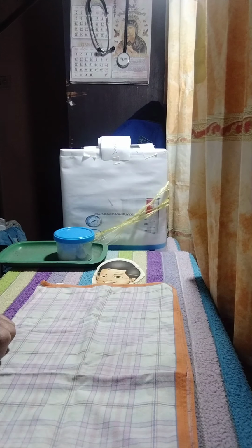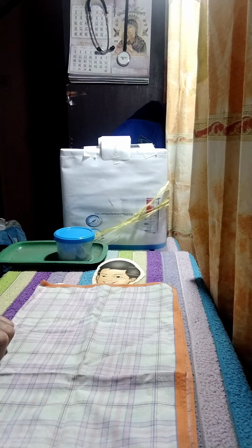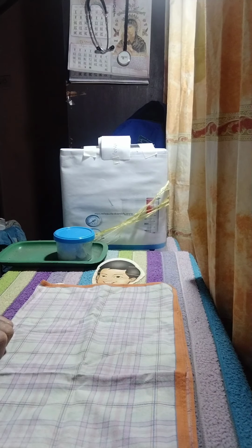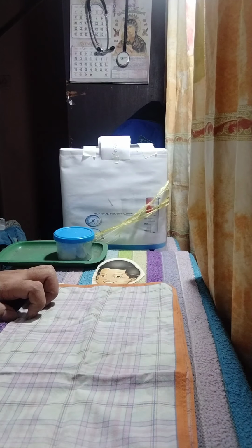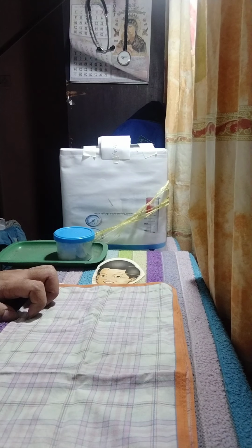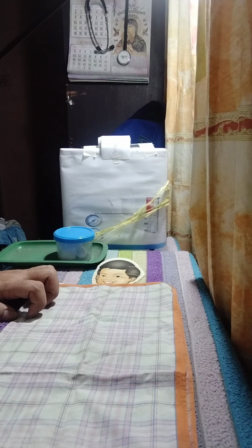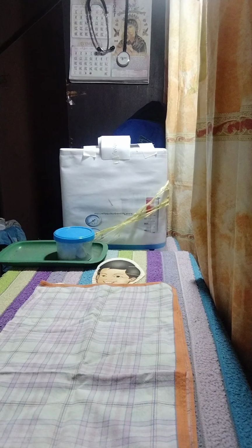If possible, as you set up the machine, record a 12 lead ECG and explain the procedure to the patient. Tell the patient the test records the heart's electrical activity and it may be repeated at certain intervals. Also, explain the procedure to the patient. So, good afternoon, sir. Today, we're going to perform obtaining an electrocardiogram. This will give you information about the size of your heart's chambers and the heart's position in the chest. It also can monitor the effects of medication and evaluate the function of an artificial pacemaker.